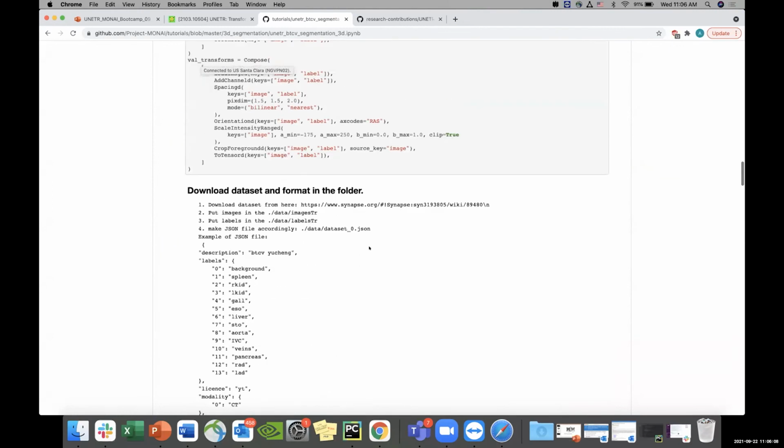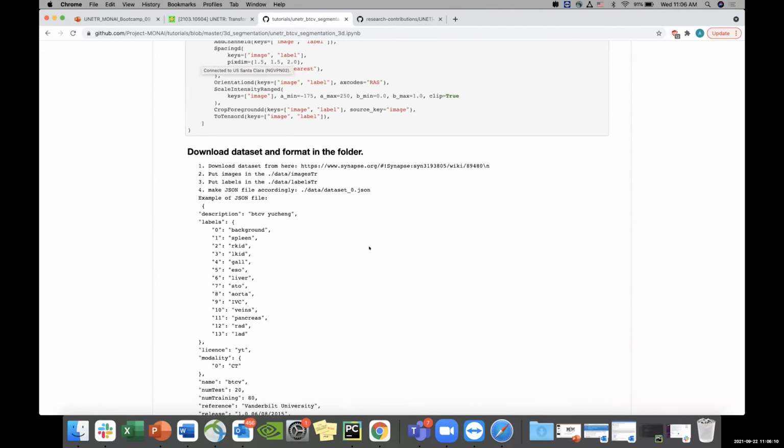So you don't need a larger data set than a CNN-based model to train this transformer model. So it worked pretty nicely for us in this application. I think we also applied that to a spleen segmentation, which is also a very small data set on the MSD. We also outperformed a state-of-the-art CNN-based model. So typically it's not a data hungry methodology.